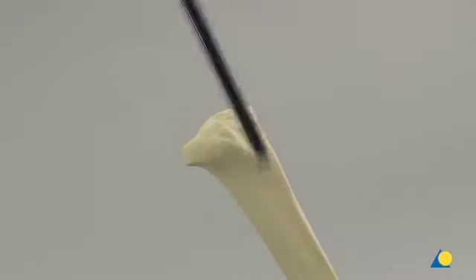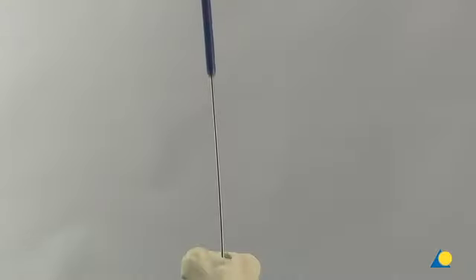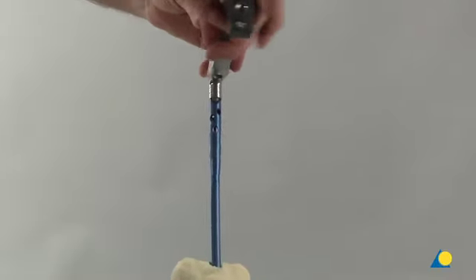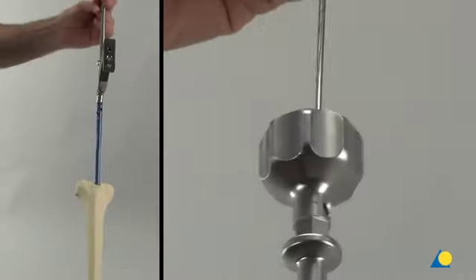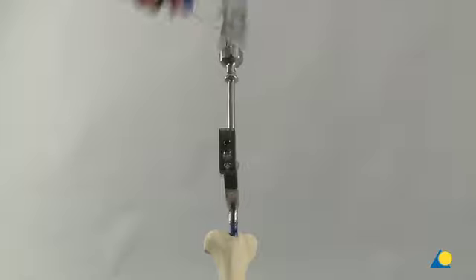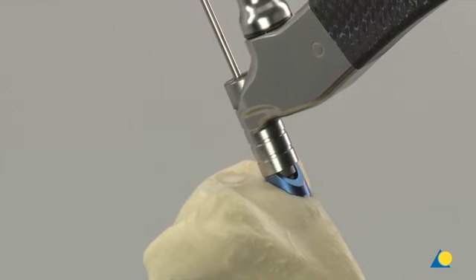The nail is inserted over the guide wire into the intramedullary canal. A wriggling motion can be used to advance the nail. If needed, light, controlled hammer blows can be used to seat the nail. The passage of the nail across the fracture is monitored and controlled with image intensification in two planes to avoid malalignment. The nail should be inserted until it is at or below the tibial opening.